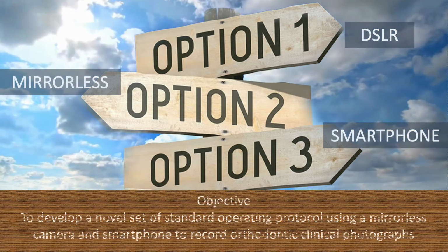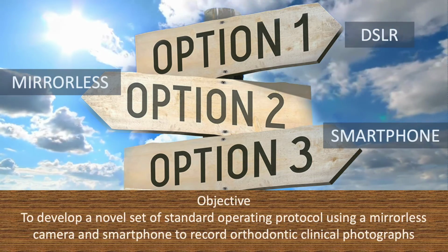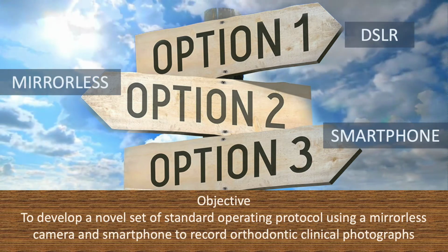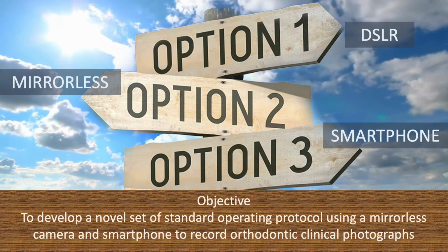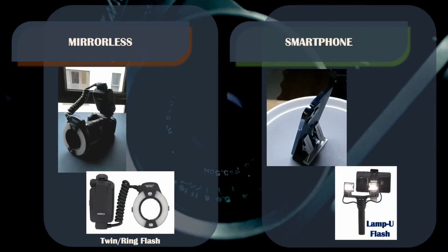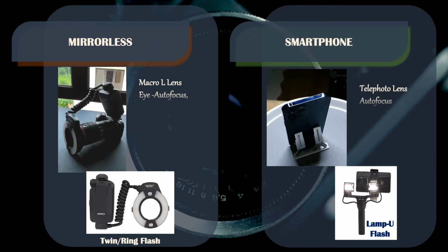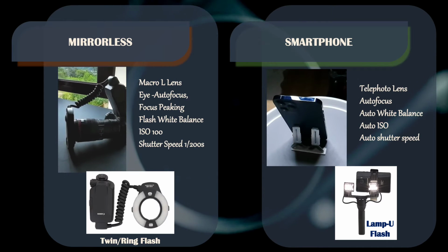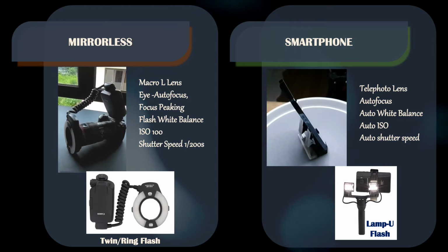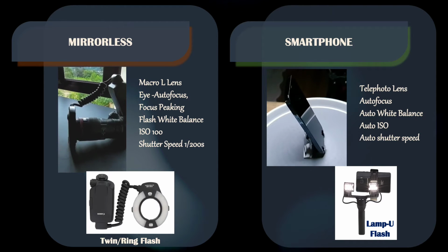The objective of this study is to develop a novel set of standard operating protocols using a mirrorless camera and smartphone to record orthodontic clinical photographs. The camera settings recommended are listed here. The examples of mirrorless camera and smartphone described in this study are from Canon and Apple.